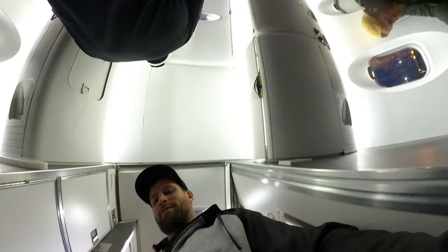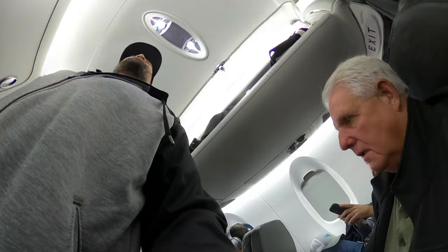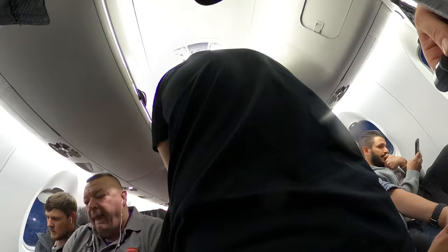It's raining down here. Last on the plane. Yeah, absolutely. Welcome aboard. Now that we have gotten off our power wheelchair, we can now take our seats. But if you are unable to walk, you can ask for assistance and you will then be placed on a wheelchair that is meant for an airplane.